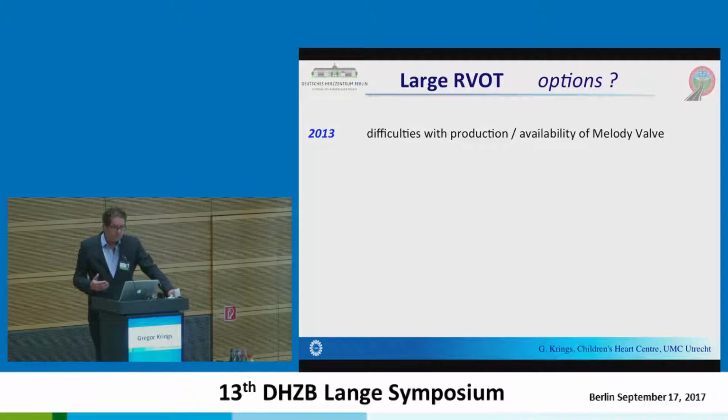And for me, coming from Berlin, and therefore being very close to all ideas around Bonhoeffer's valve, I was a MELODY guy. But by 2013, this changed a little bit necessarily, and I had to open my mind because we need another product. And this is when we opened up for the Sapien products. I went to Edwards, to Irvine in 2014.